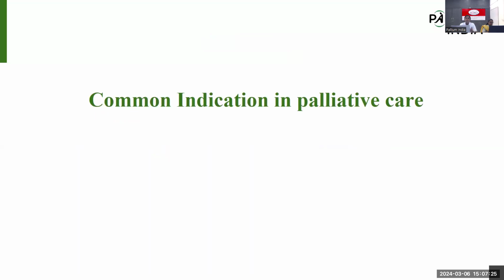But in palliative care, what are the common indications? What is the importance of subcutaneous infusion in palliative care? Dehydration.